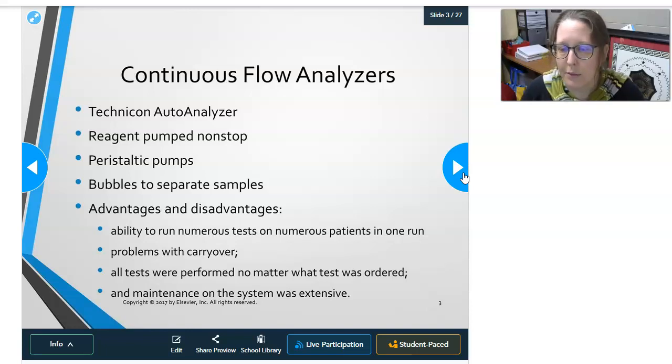This reminds me a little bit of the hematology analyzer for CBCs. In those types of analyzers, when you run a tube through it, it runs all the tests. It runs the CBC and the diff every time, regardless of whether the physician ordered a CBC with diff, a CBC, or just an H&H. It just runs all the tests. So that gives you kind of an example there.